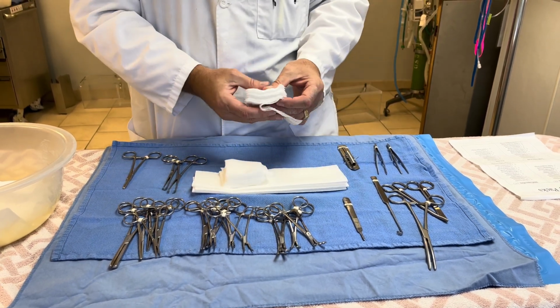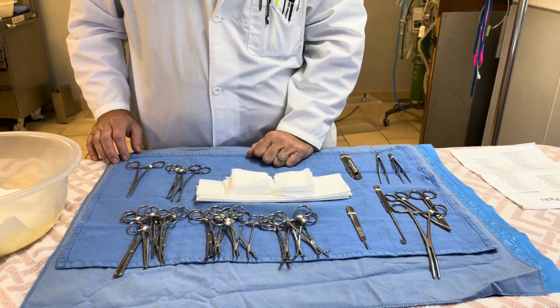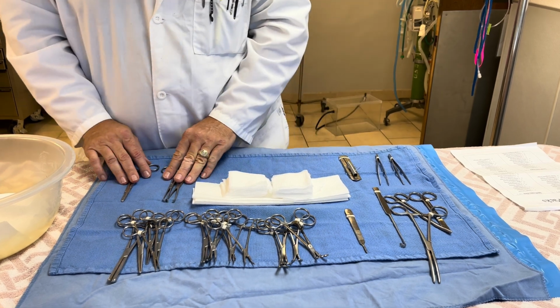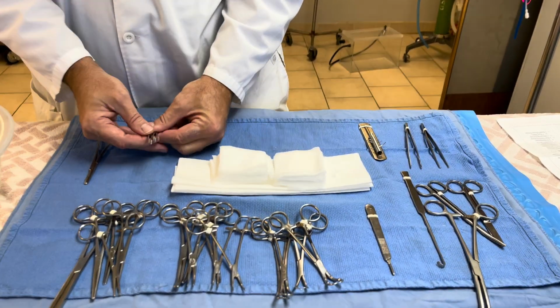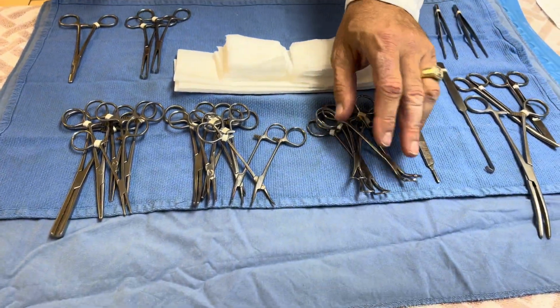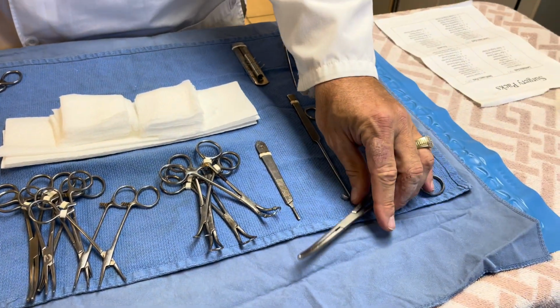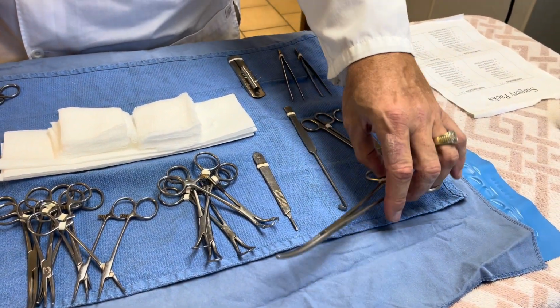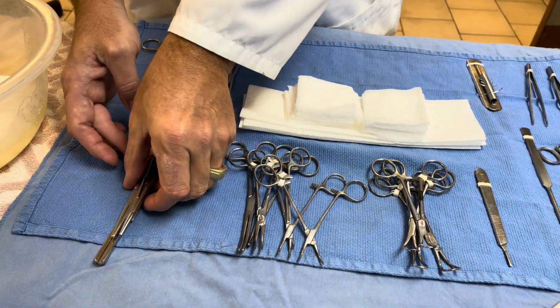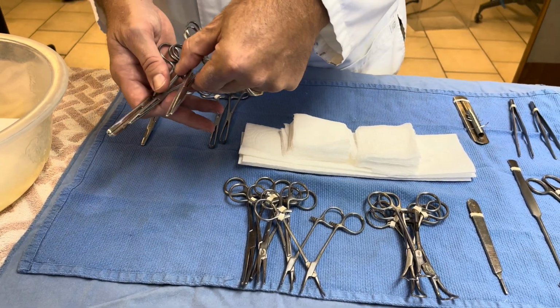And then you want a couple of 1-inch size stacks of gauze, okay? And now, this is the simple part. You want to group your instruments, okay? So your Alice atraumatic tissue forceps together, your drape clamps together, your big Carmalt, the big curved Carmalt, if you have it, that's for a spay pack or for a large pack. Just keep it over to the side, and then you want to put your flat Carmalt and your flat hemostats together.